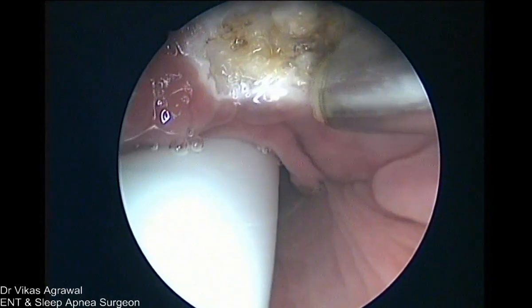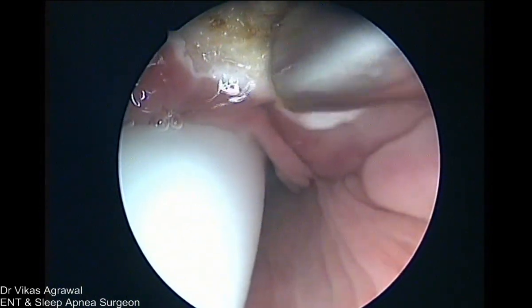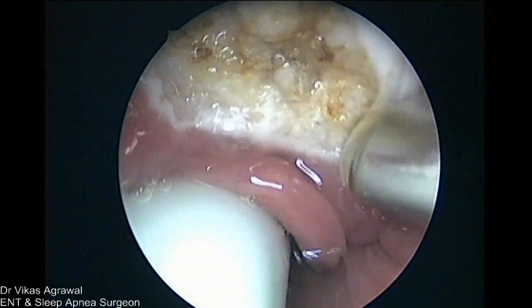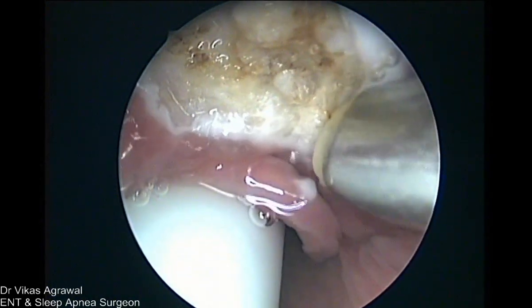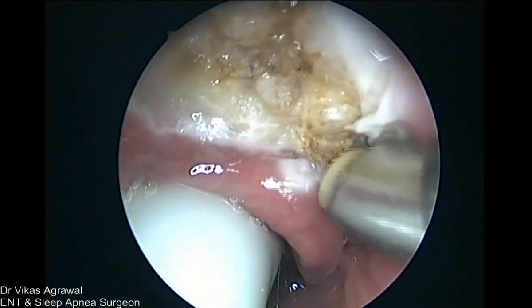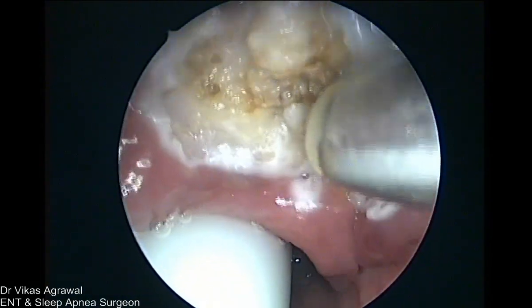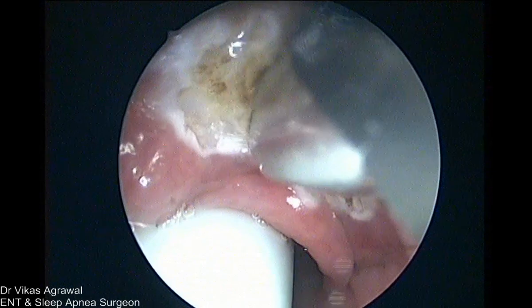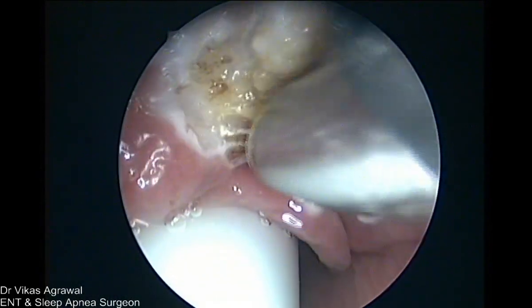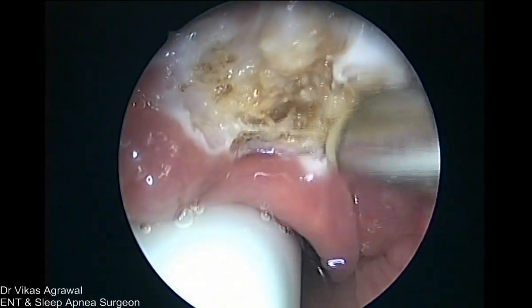There is a question on lingual artery. Do you still use the USG to delineate? Absolutely, but only if the tongue base is really big. Question is that lingual artery, where it will come, do I use the Doppler? Yes. We use the Doppler if I am going very deep into the tongue. Otherwise there is no need. So here we are going into the midline. We are not really going too much deep laterally into the muscle. So lingual artery is not in question at all.